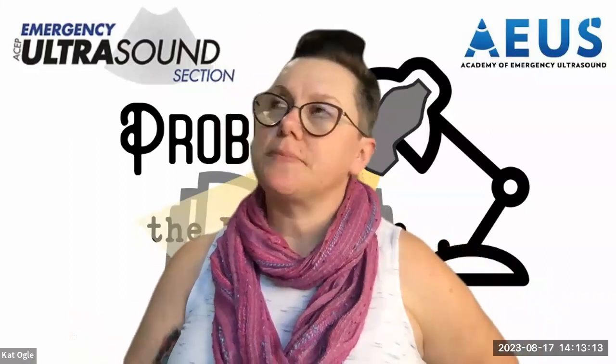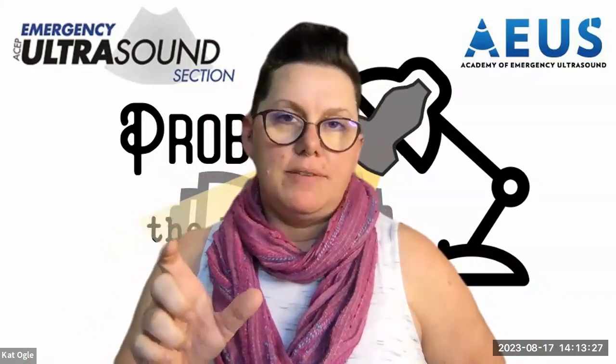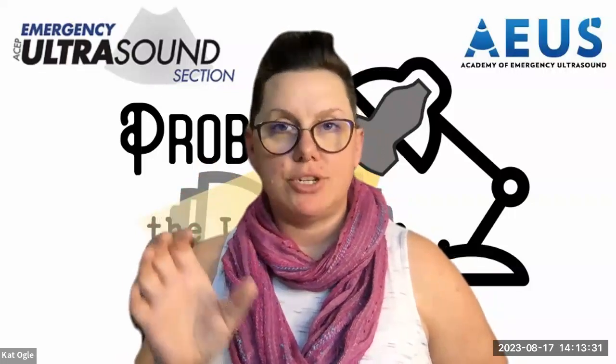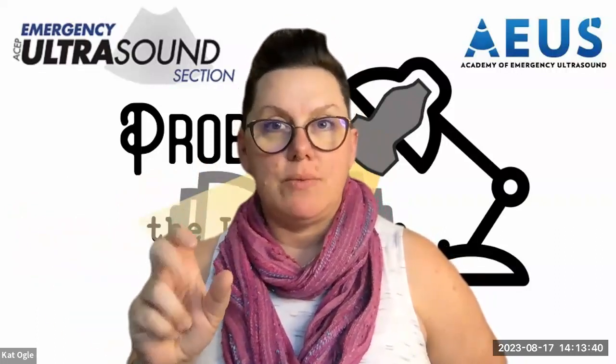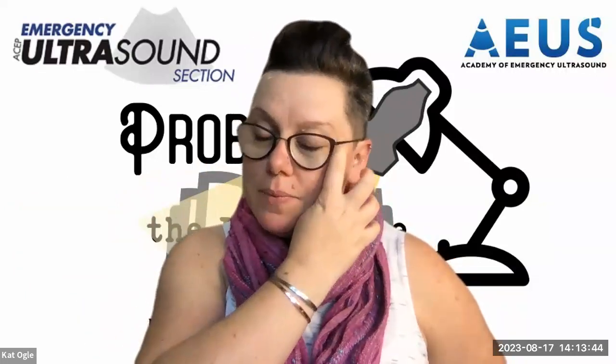So the ones that were finally analyzed, we looked at those images independently of the interpretation, just to see that our interpretation matched the documented interpretation. There were a couple of situations in which our interpretation didn't match the documented interpretation of the resident, which is what you would expect when you have a false positive and false negative. But when there's a disparity, we actually had a second reviewer come and take a look at the images independently of that data as well.